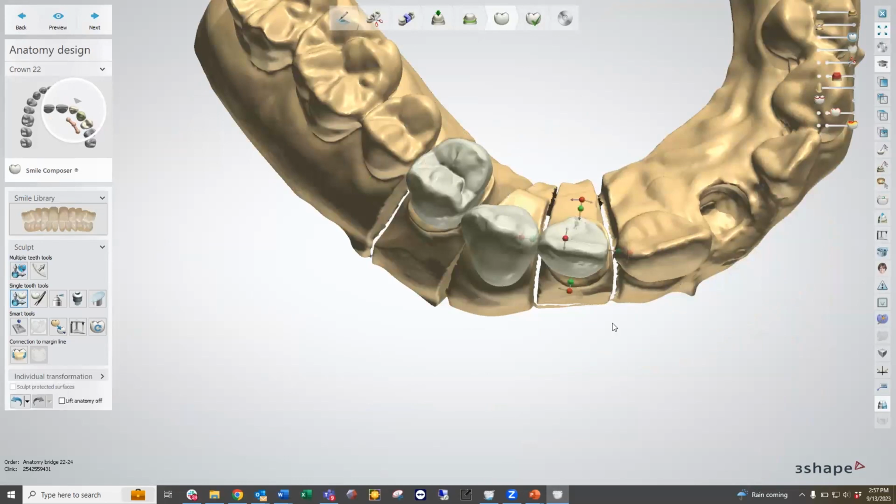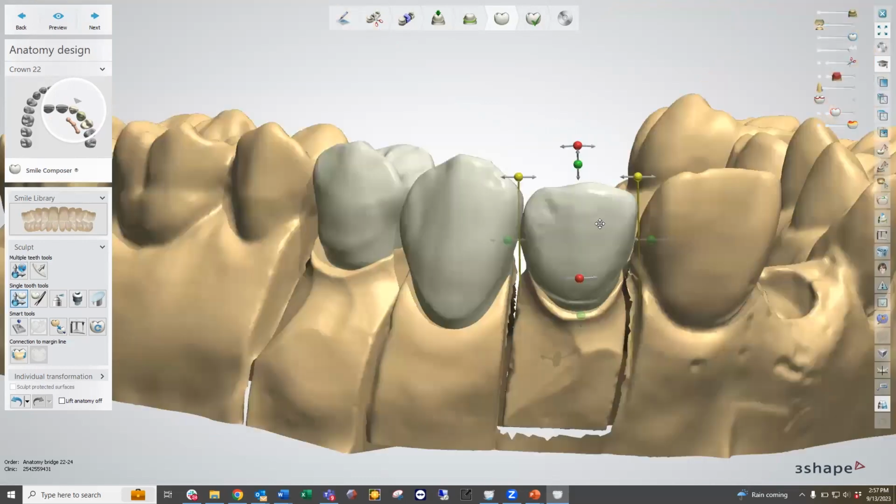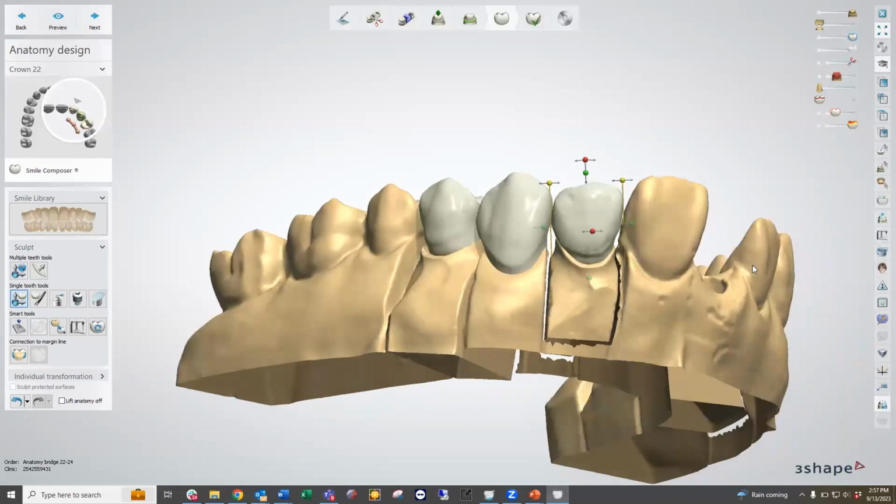So now moving on to single teeth tools, because I think they look pretty good as they're sitting here. I might need to change this one just ever so slightly, rotate it, drag it out, make it a little bit wider. So it kind of encapsulates there. See how this lateral looks a little bit skinnier. So I might drag this one in skinnier and taller, make it lean out a little bit more.